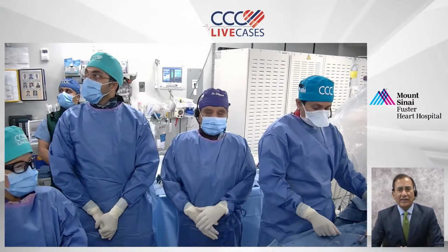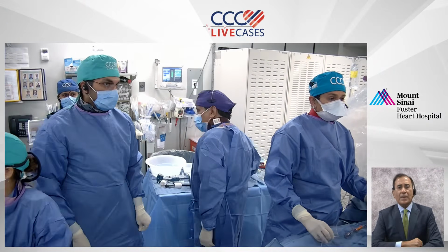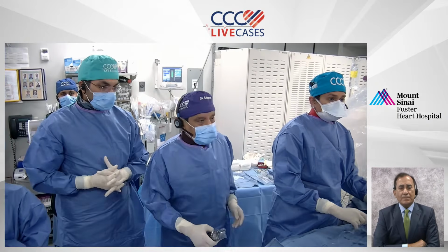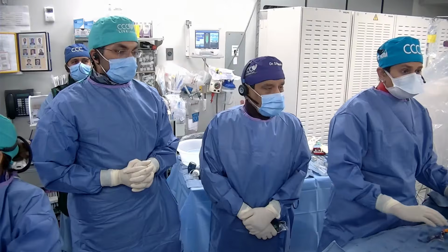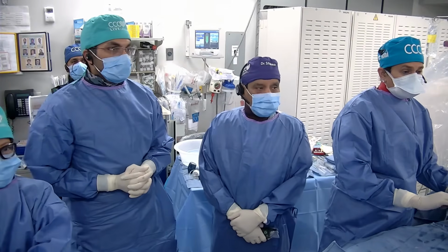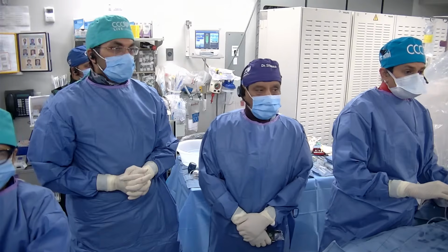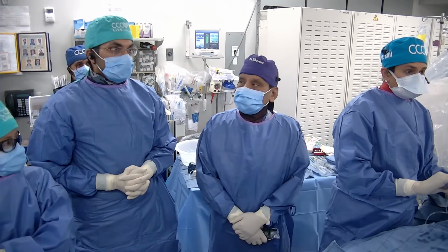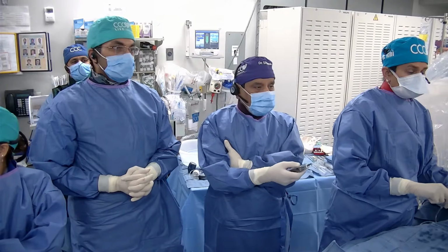Good morning. Very happy to be here with our team, and this is the new strategy, which, as you mentioned, is being done quite a bit in Europe, but I think it's now just catching up, based on many data that side branches do very well with a drug-coated balloon and a stent may not be needed. With that note, we actually have our case.